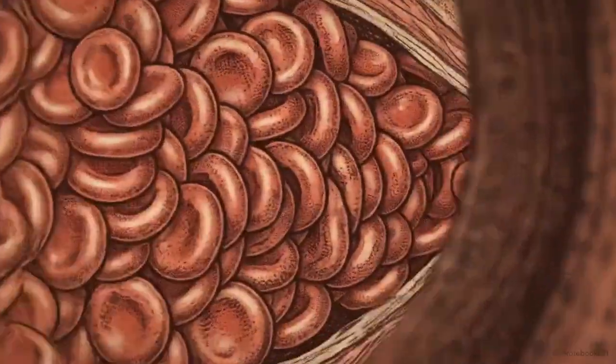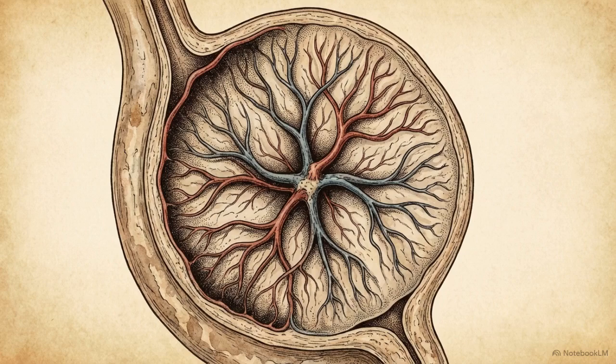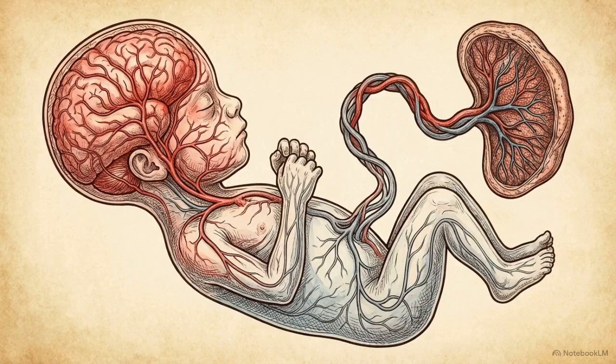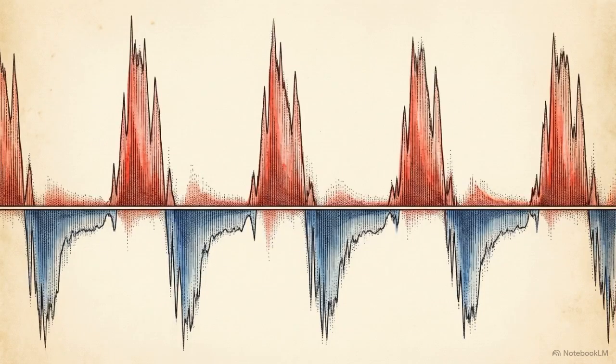It is almost exclusively the result of maternal vascular issues, specifically chronic high blood pressure or preeclampsia choking off resources to the placenta. The preserved head size confirms that resources are being prioritized for the brain, but physical dimensions cannot confirm if the organ is actually receiving adequate oxygen. For that, we must measure the invisible fluid dynamics of the blood itself.